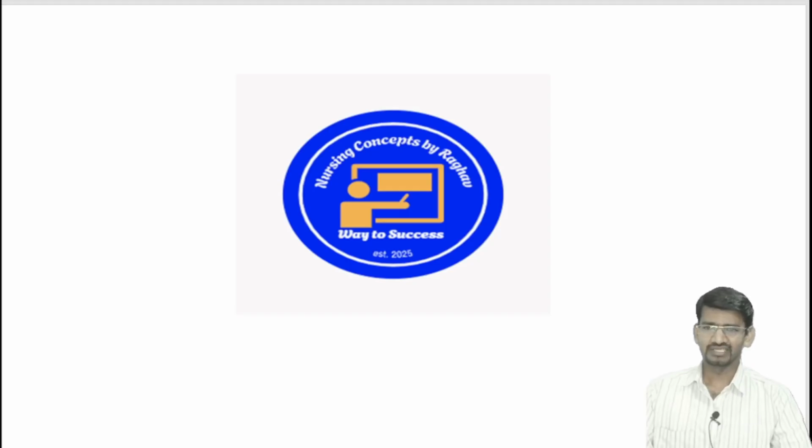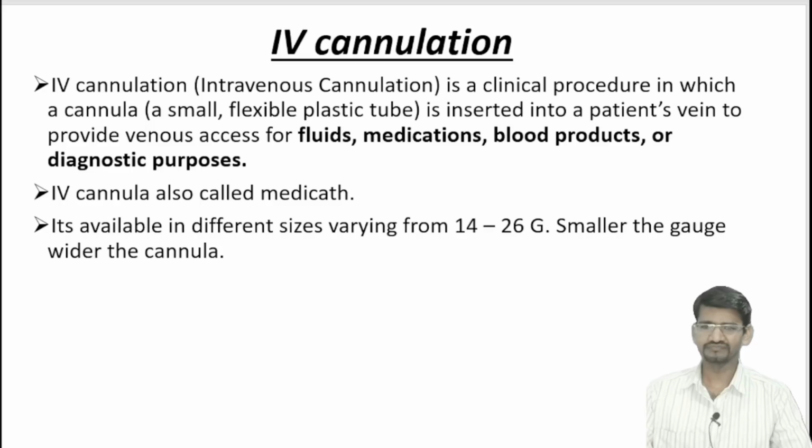It is a very simple clinical procedure, that is IV cannulation. So let's start the discussion of IV cannulation.